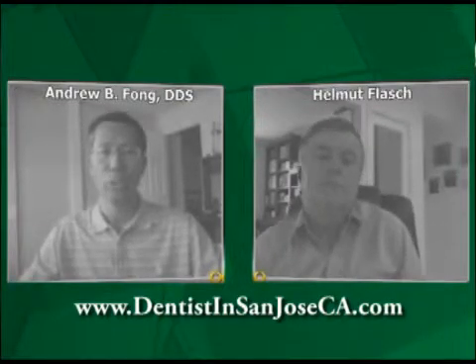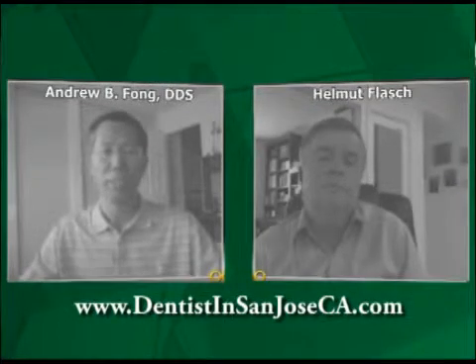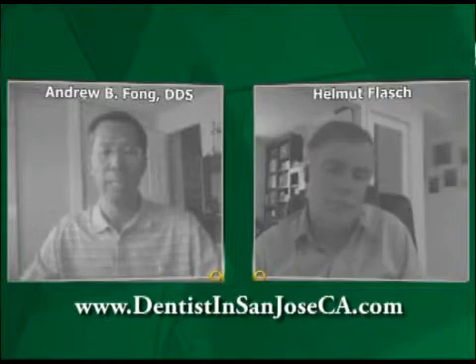So can that be reduced? Is that like cover on the palate with the implant-supported denture still there, or is it gone and you can now taste food better? Yes, you're right. The roof of the mouth, also called the palate, when it's covered, it reduces your ability to be able to taste and enjoy the food. You're not able to experience the textures of the food, and you're not able to taste it.